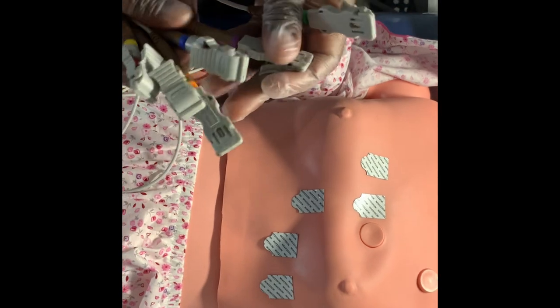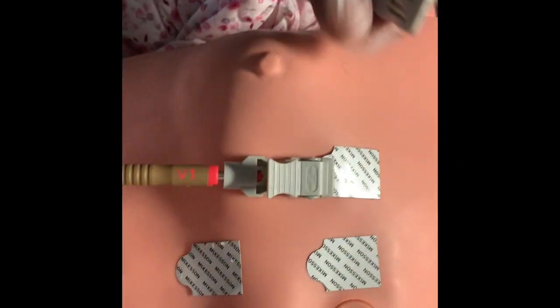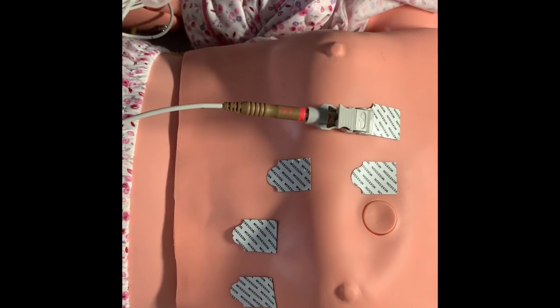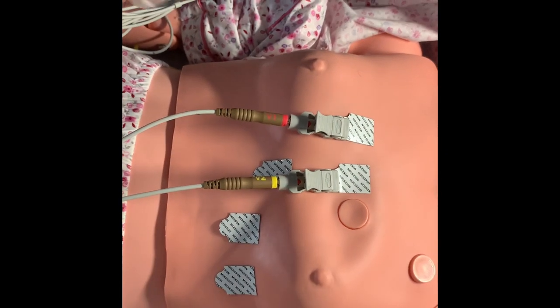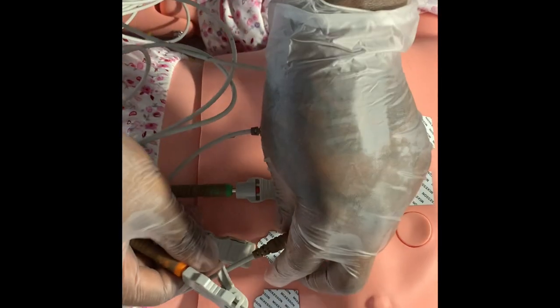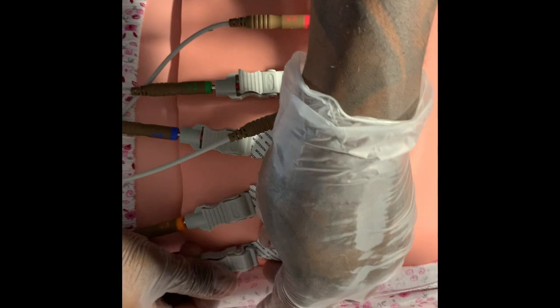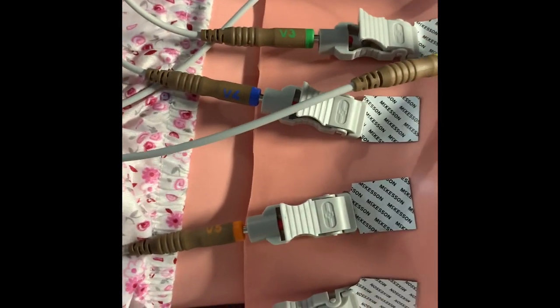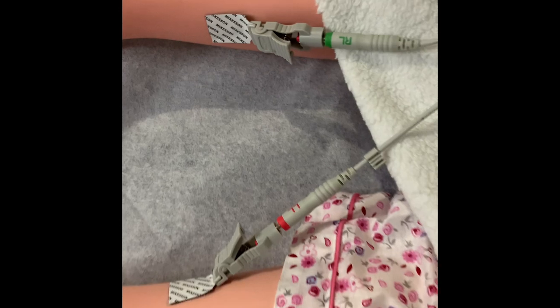I'm going to put my leads on the patient's chest, starting with V1. V1 is on the patient's right side — this is where we start. V2 is right here, then I'm going to make my way over to the patient's left side. V3 is here, then V4, V5, V6. It's extremely important to make sure you place these properly on your patient. You always want to double-check that your leads are placed properly on the patient's electrodes.